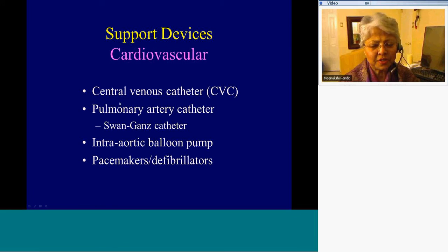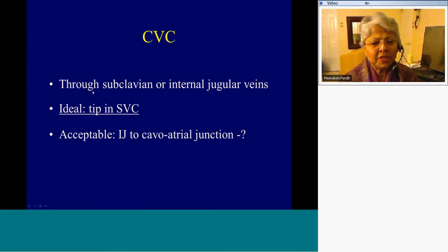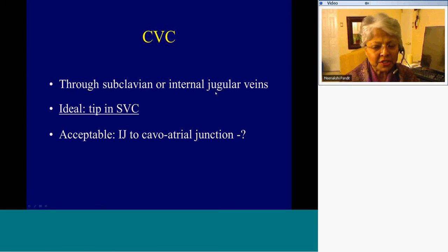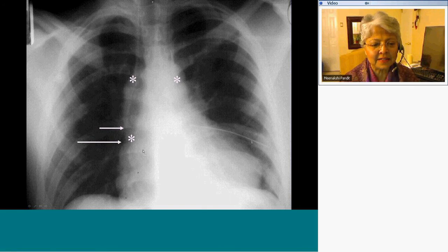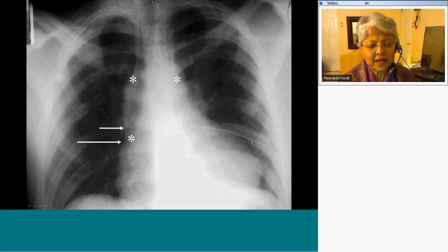For cardiovascular support devices, I will discuss the central venous catheter, pulmonary artery catheter (also called the Swan-Ganz catheter), and the intra-aortic balloon pump. The important position for the CVC is in the superior vena cava — it can be placed via the subclavian or internal jugular veins. If in the IJ, it can extend up to the cavoatrial junction and is acceptable. The last set of venous valves are behind the medial ends of both clavicles where the innominate veins begin, so anywhere medial to that point, to the cavoatrial junction, is acceptable.